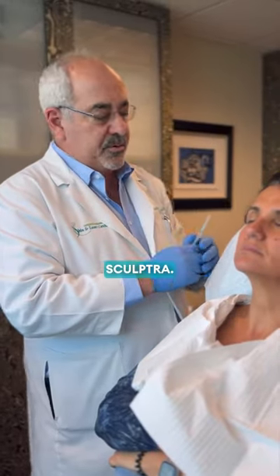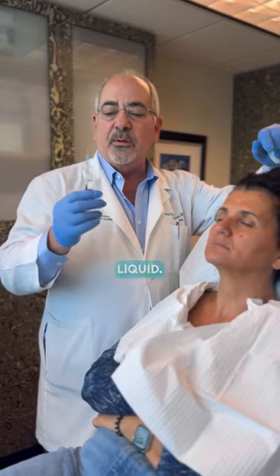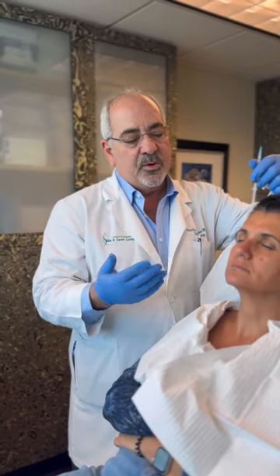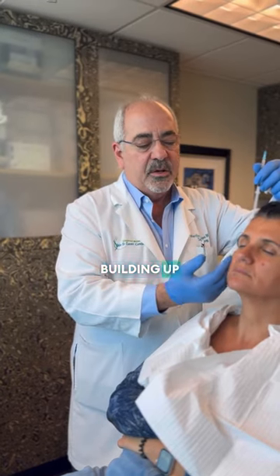Today we're going to do a treatment of Sculptra. Basically it's a biostimulatory — it's not a filler. It's basically liquid little particles. Those particles stimulate the fibroblasts in our skin to produce new collagen and new elastic fibers. It's more natural. It's not that fullness that you get overnight, but it's a building up little by little.